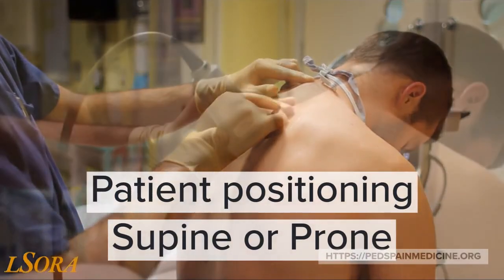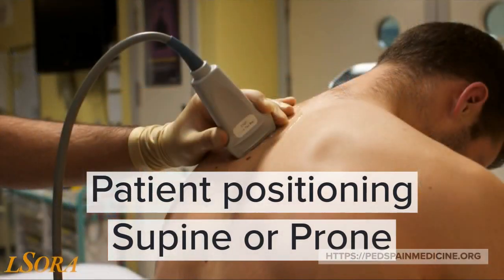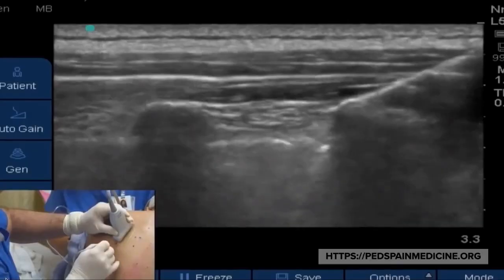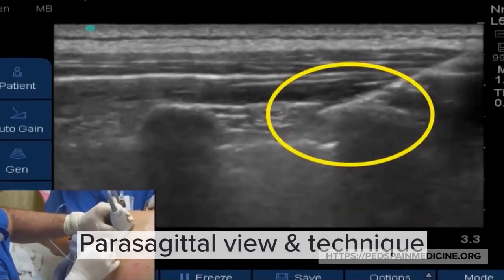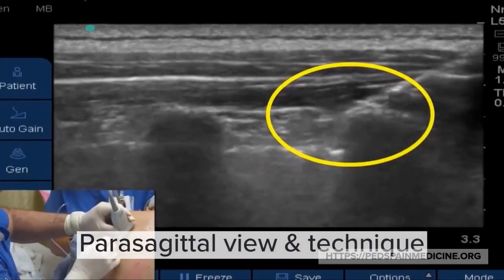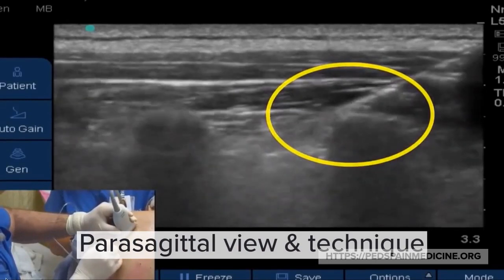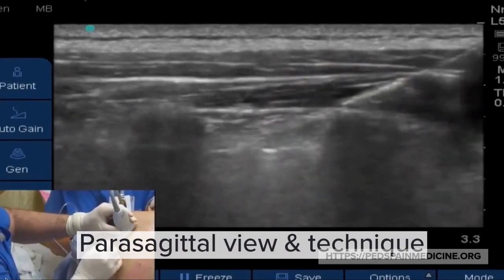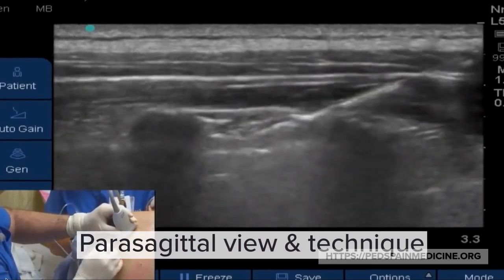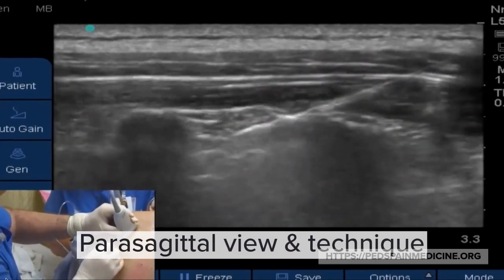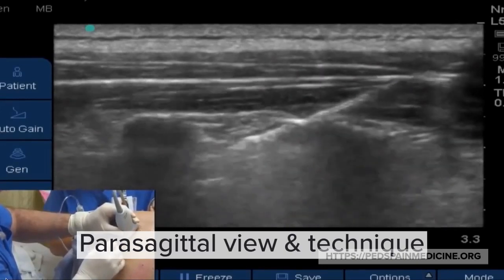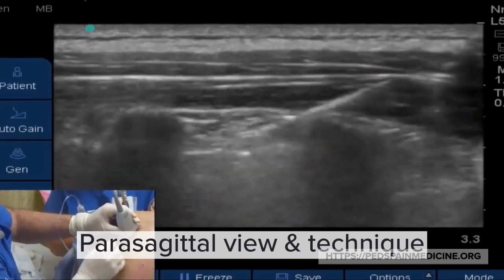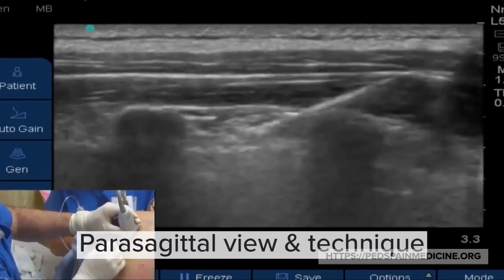Patients can be positioned supine or prone. This is the parasagittal viewing technique. Needle tip visualization is very important. Careful hydrodissection technique is needed. The paravertebral space is reached when the pleural lining will drop.